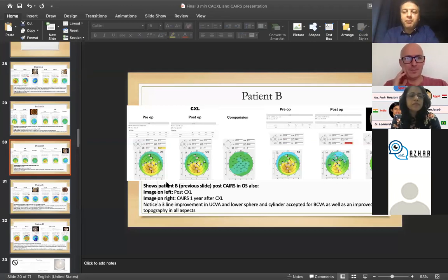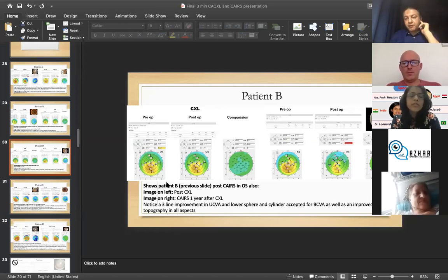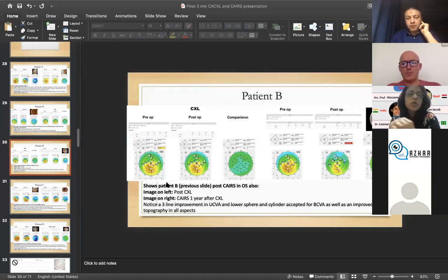It's a very good question, because we are following a nomogram in the synthetic intracorneal ring segments. Because it's a tough, hard material, the thickness will be different. There is a nomogram for that. The principles of the nomogram are actually similar to that of ICRS. You can play around with the optic zone, the arc length and the thickness that's implanted. Another additional thing that you get here is the depth of implantation, but I keep the depth of implantation as standard 50%. I don't change that. It's 50% of the thinnest pachymetry in the zone of implantation.